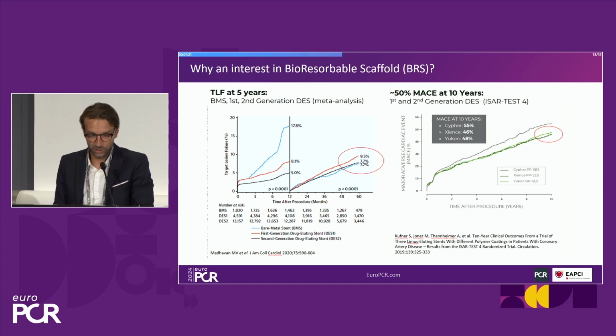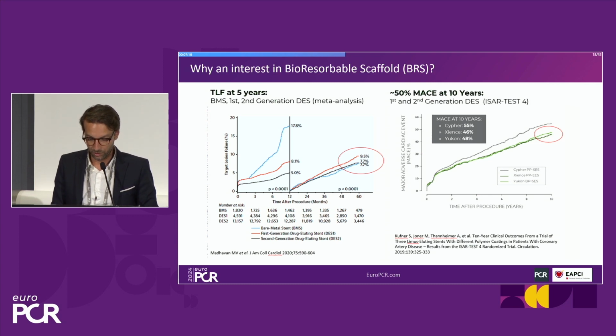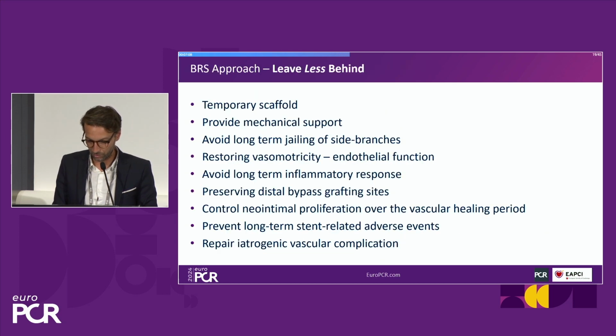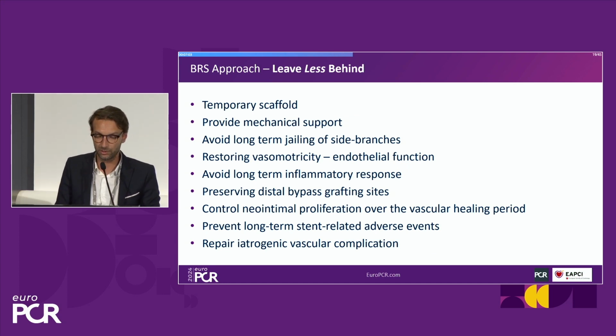So why are we interested in bioresorbable scaffolds? Because stents were a revolution in the past, but they're still responsible for stent-related events, with an increase over the years. And for the last 30 years, we've been interested in bioresorbable scaffolds and the leave-less-behind strategy. The idea is to have a temporary scaffold that provides mechanical support during vessel healing, to preserve distal bypass grafting sites in case of disease progression, and to prevent long-term stent-related events.